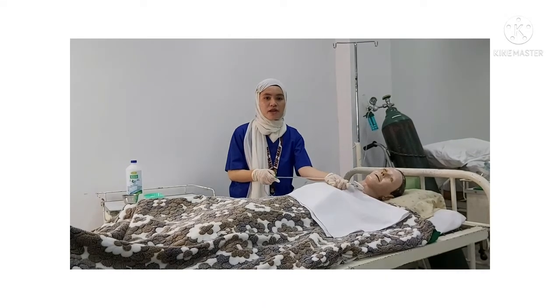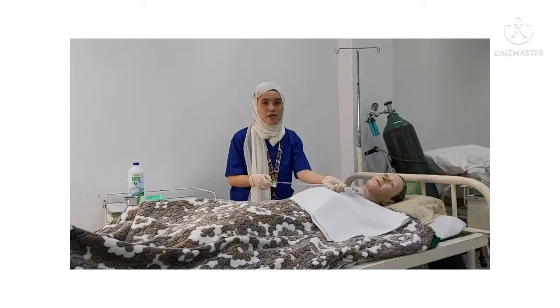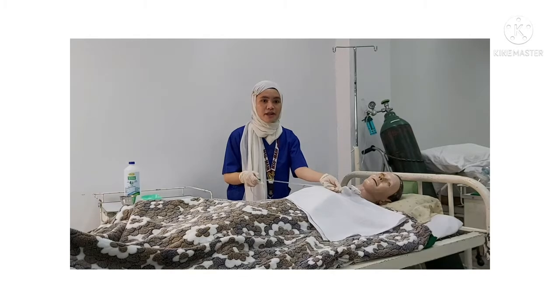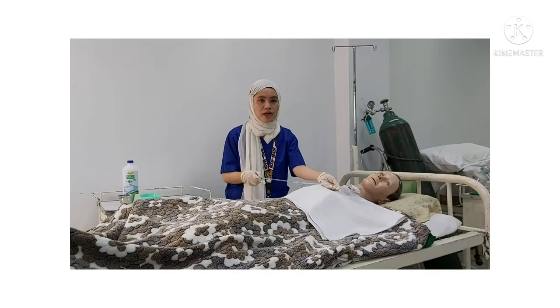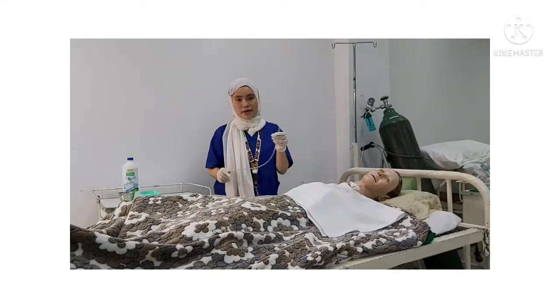This prevents tissue trauma by minimizing the suction time against any part of the trachea. Now release the suction and withdraw the catheter completely to minimize oxygen loss.